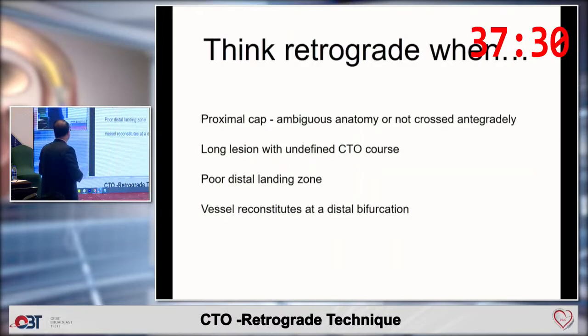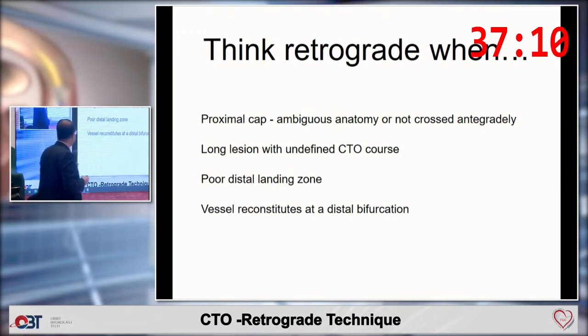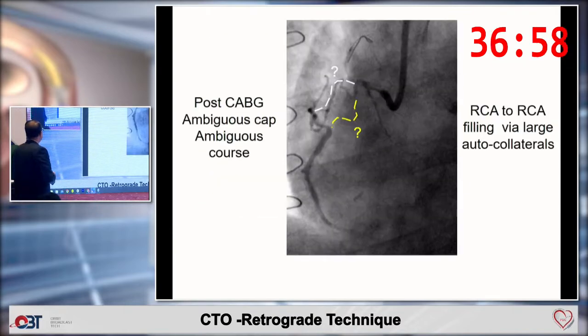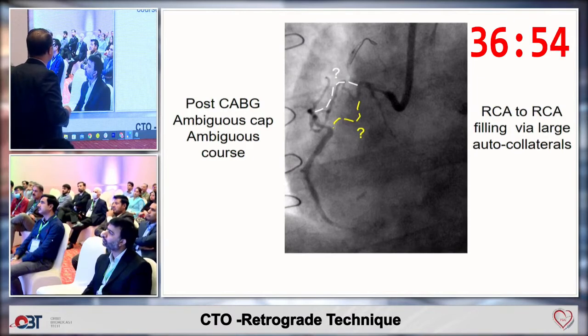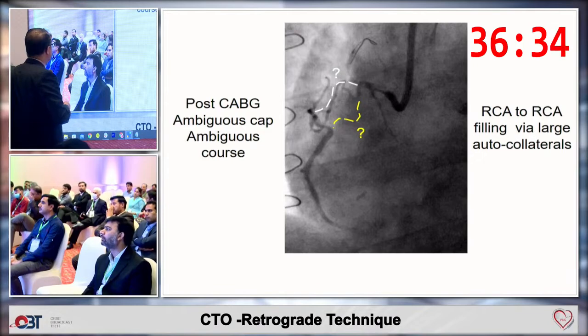So again, the same things: proximal cap ambiguous, long lesion, poor distal landing zone, and this is another important point. If your distal cap is at a distal bifurcation, and you do an antegrade approach, you might lose one of the side branches. So you have to go retrograde if you want to preserve side branches in such a situation. So this is an additional point. This is an RCA CTO. These are bridging collaterals, and the proximal cap is ambiguous, the route is ambiguous. So although nowadays, if you have a good landing zone, antegrade dissection re-entry would be preferable, you can think of retrograde in this case as well.